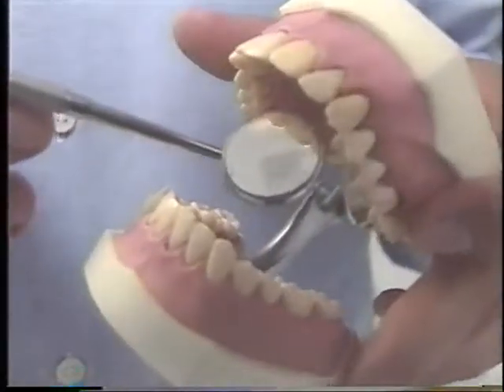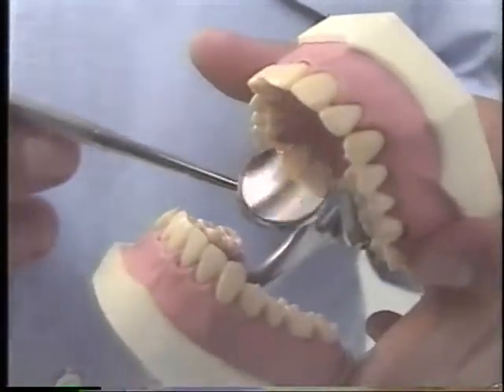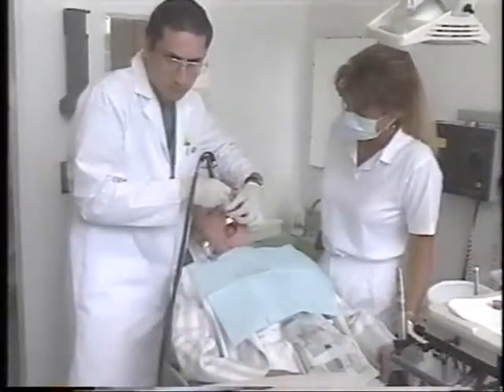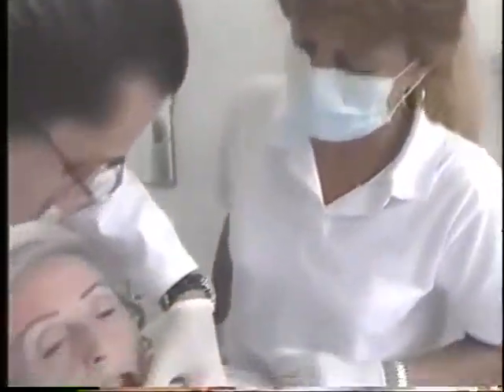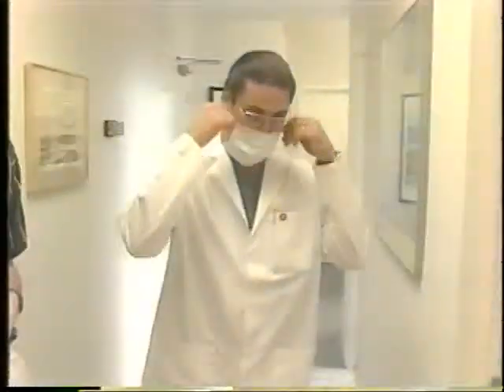Before this new technology was available for dentists, this is the view that the dentist would have of the patient's mouth. The only problem here is that the patient couldn't actually see what was going on inside and couldn't be told exactly what was wrong. Now it's in color. In fact, this video scan device, which surgeons have used in one form or another for years, probes at angles that were difficult, if not impossible, to duplicate before. It grabs images, splits them on the color monitor, takes a picture, and makes a hard copy for the dentist and the patient to discuss.